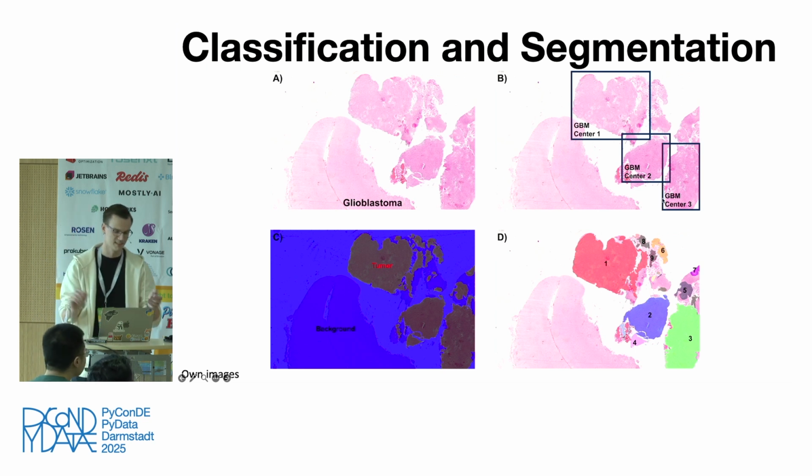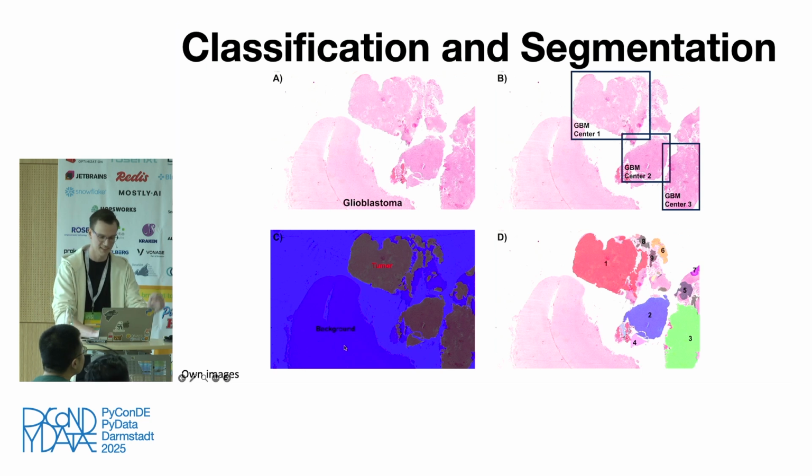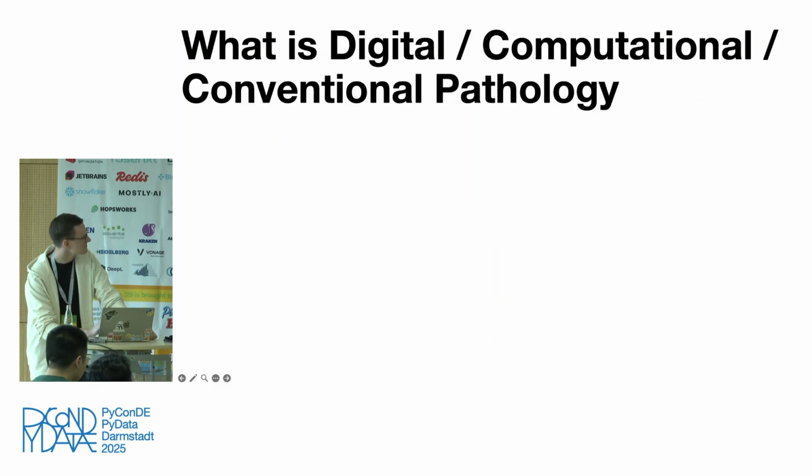This is an object detection-based approach. Then we go into the semantic segmentation approach, where we just label every pixel with either our class we care about or something else. And then we also have instance segmentation, which differentiates between different objects we have. Is this really important for today? Definitely not, but I told everybody you will learn something about computer vision, so done.